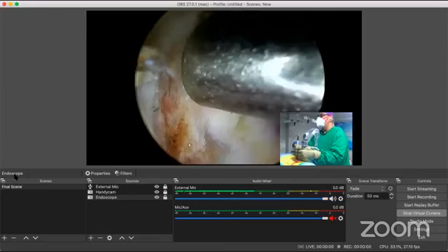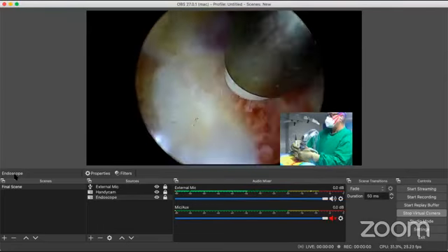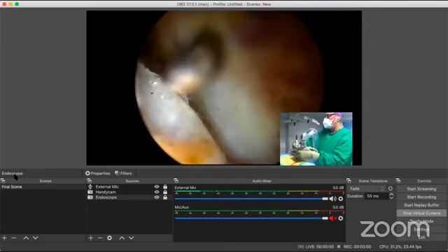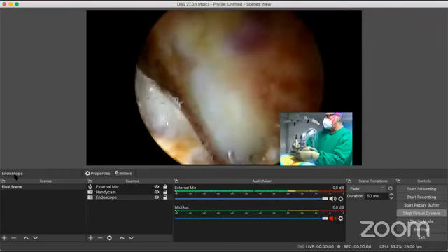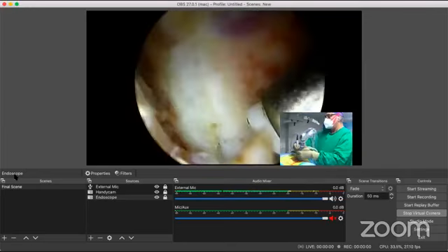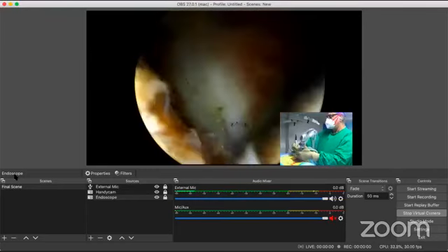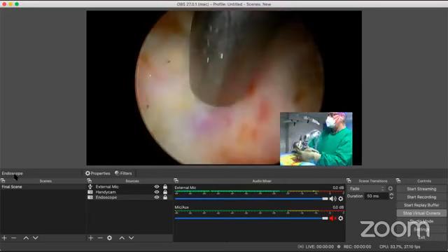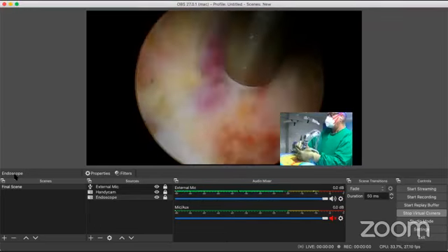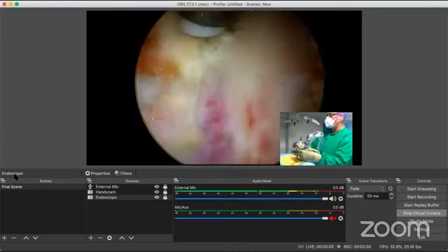I'm trying to control. I want a very pristine and a clear field when I do the final opening up. Endoscopy is all about clear vision. You can't compromise on it, friends. Patience is the aim of the game. And bleeding control, most important. You can see how the phlegm is separating out from the edge here.